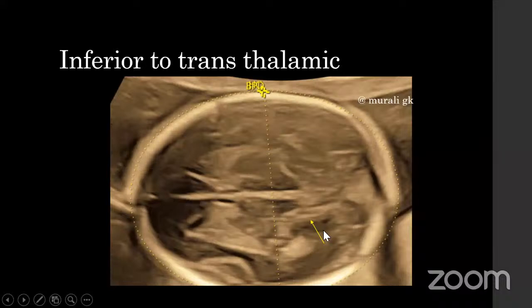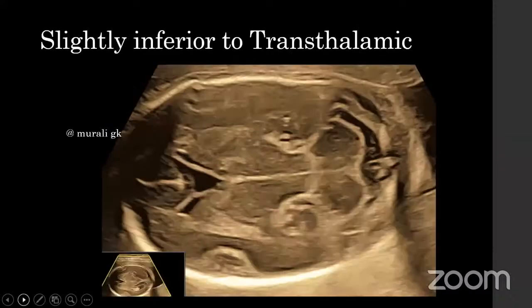At this level, what I want to show is also the hippocampal gyrus. I'll come back to that. So slightly inferior to the thalamus, you are nicely seeing the two thalami, but this is not completely the transcerebellar plane, it is slightly inferior to the transthalamic plane.